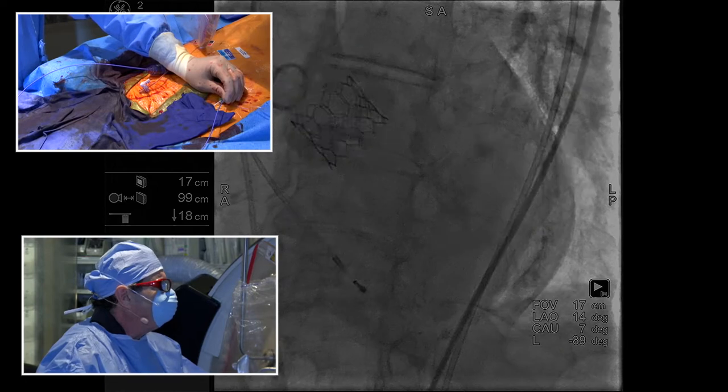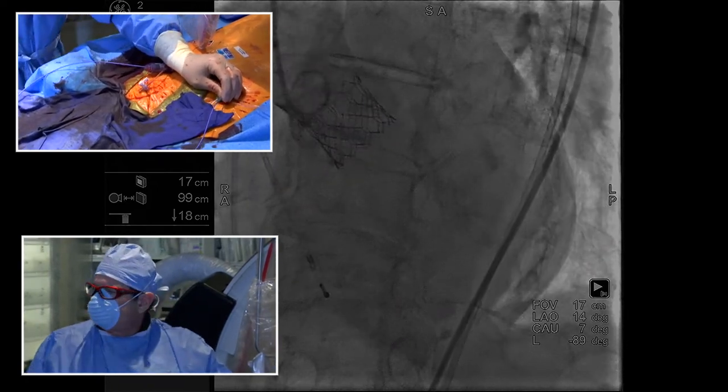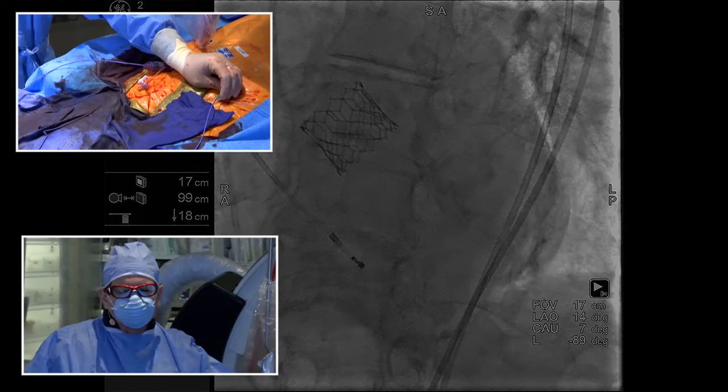What do you guys think? I mean, you could really do either one here. What about LVOT? Was there a lot of LVOT? She had a nice chunk of calcium, so maybe just leave.